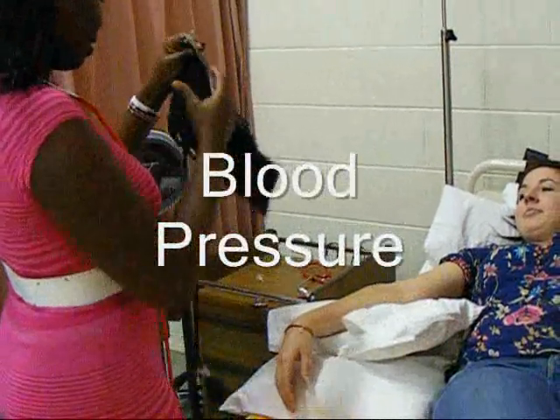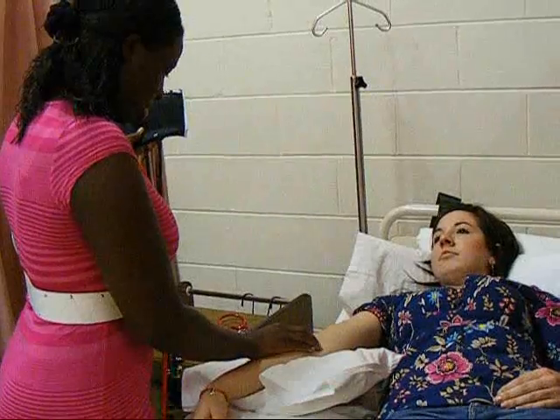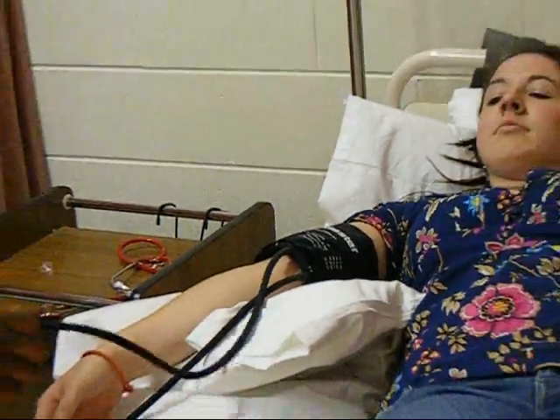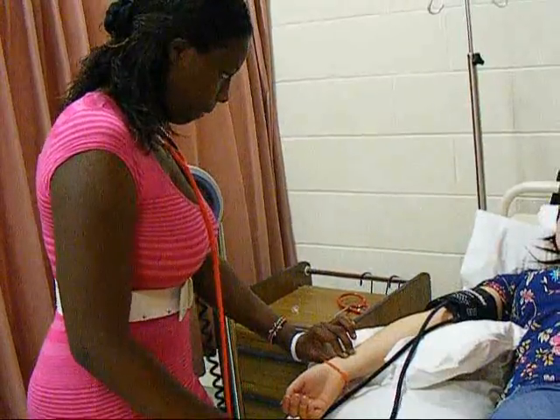Position the patient seated or lying in bed. Position the sphygmomanometer within one meter of the patient at eye level, at heart level, supported by a pillow, with the elbow relaxed. Palpate the brachial artery, place the cuff, inflate and palpate for pulse obliteration to get an estimated systolic BP. Deflate and place the stethoscope.